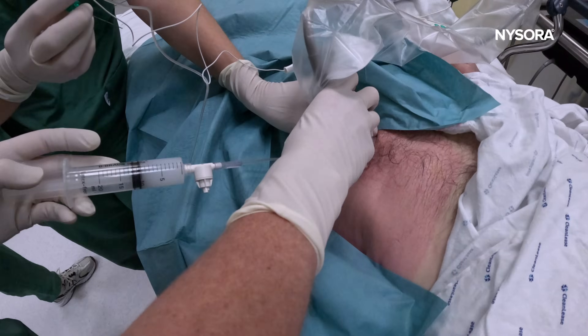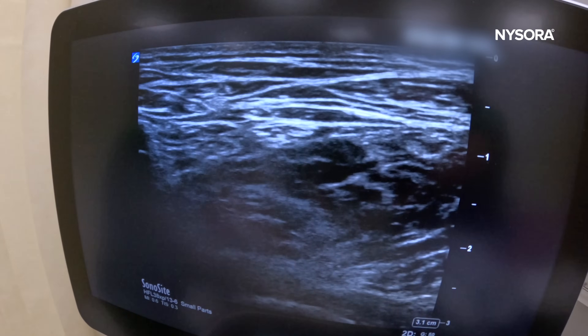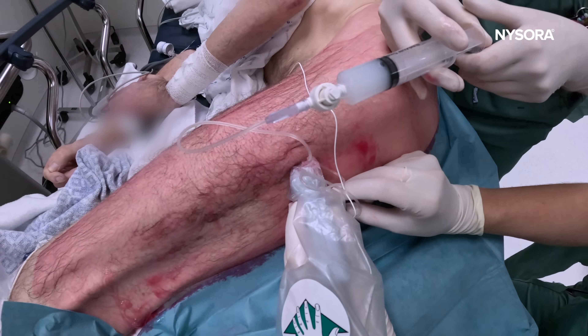In this video, we will demonstrate the effective use of combined femoral and subgluteal sciatic nerve blocks in patients who are poor candidates for general and spinal anesthesia.